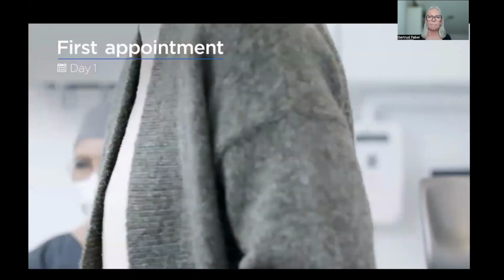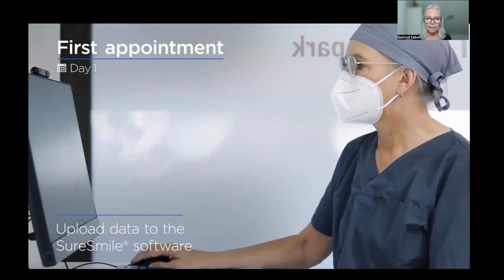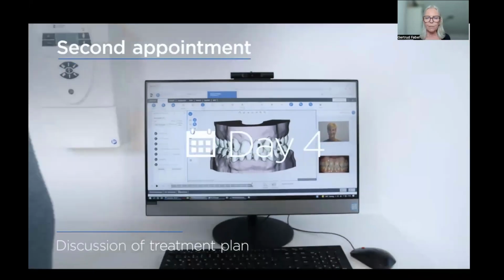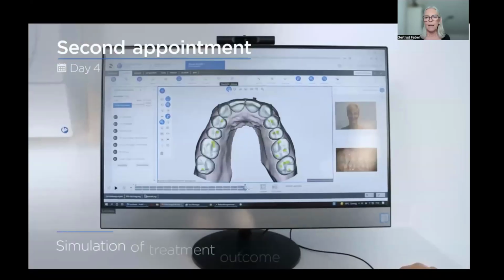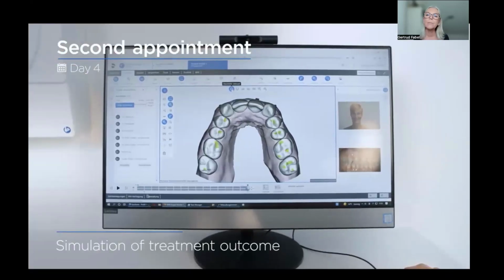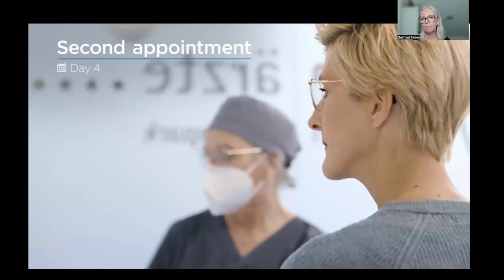And then the data upload takes place. And after quite a while, I get the staging, and I have already seen it before the patient comes, and then I explain the whole situation to him or her.